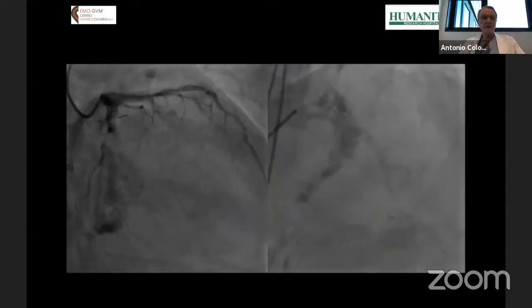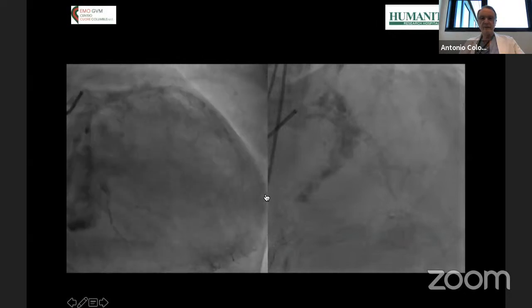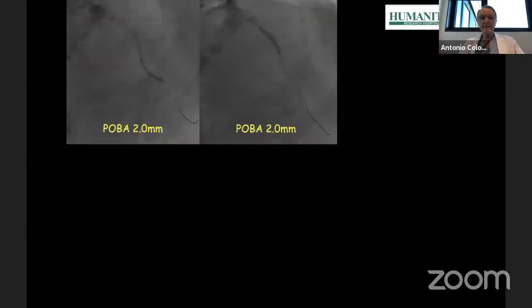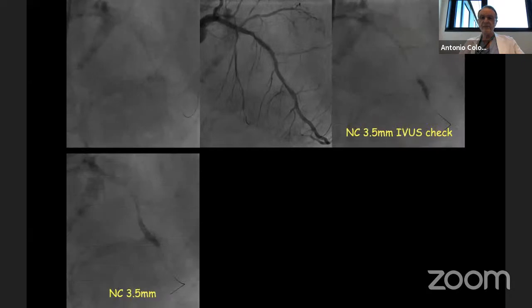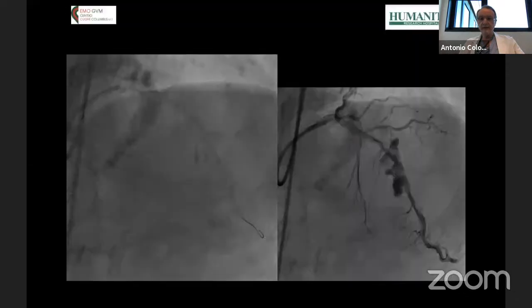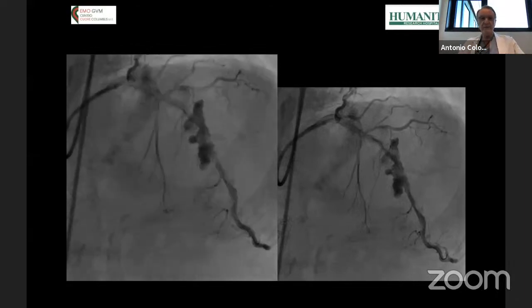In some cases, what looks like a perforation is a calcification of the mitral annulus, but you will see a perforation very soon. This severe calcification calls for an AngioSculpt balloon, a non-compliant balloon, aggressive dilatation. Maybe if you had done rotablation at the beginning, or shock wave, you wouldn't have this problem. But after multiple attempts, you get a balloon rupture. The balloon was not optimally prepared, so the compressed air pushes the dye out and you have this perforation.